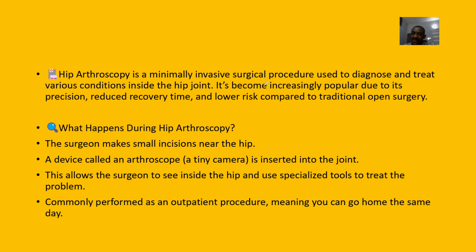So they use it to diagnose. Okay, they can also use it to treat conditions. So conditions inside the hip joint. Okay, so it's becoming increasingly popular due to its precision, reduced recovery time, and there's lower risks of complications coming up if you do this hip arthroscopy.